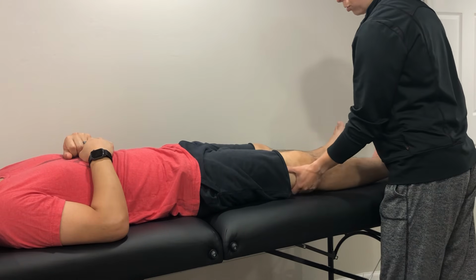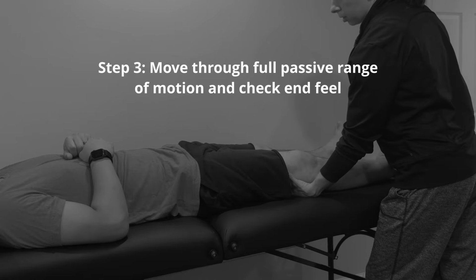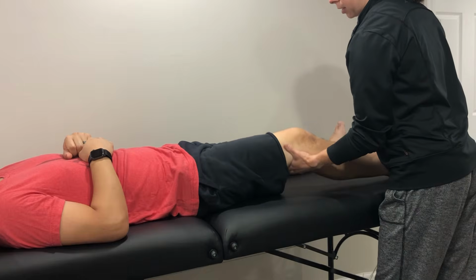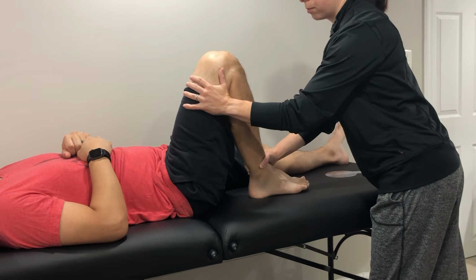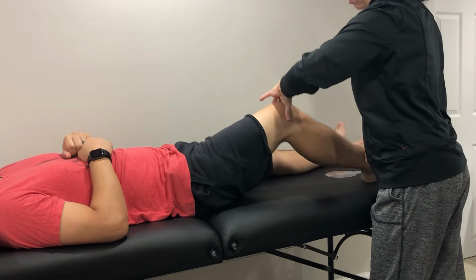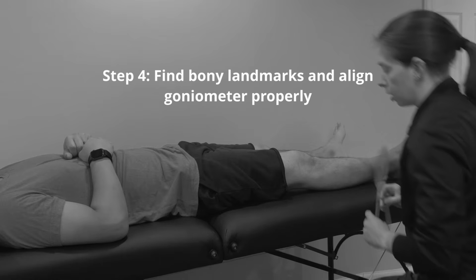Before measuring active range of motion, it's important to establish the patient's passive range of motion and to assess what the end feel is like. Comparing passive range of motion to active range of motion helps determine if any limited mobility is related to impairments of the joint structures or impairments in strength. Next, we need to identify our bony landmarks used for alignment.